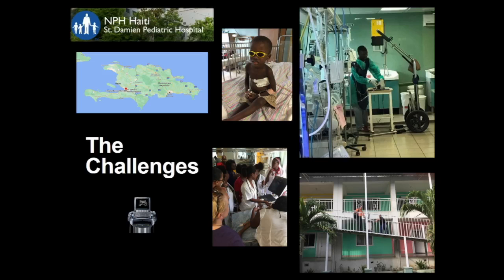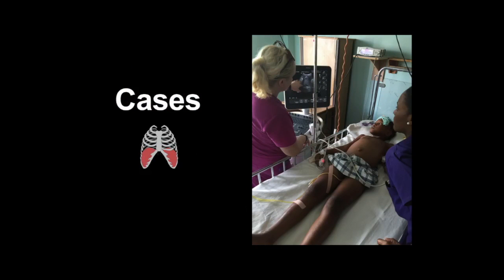But that's us pushing. Think of, listen, the emergency room is already a crazy environment. Could you imagine now outside? Is it going to rain, right? That ramp is not flat, right? And so these wheels, we were thinking of actually putting it on some tread wheels, so this way they were able to move quicker, right? But those were our challenges to use point of care ultrasound to try to get through, okay? So let's just go through a few cases here, all right?